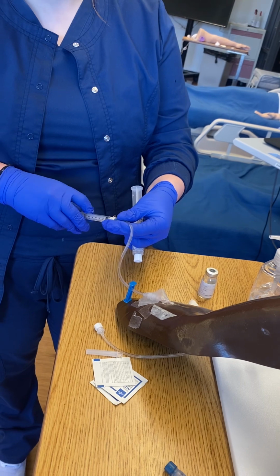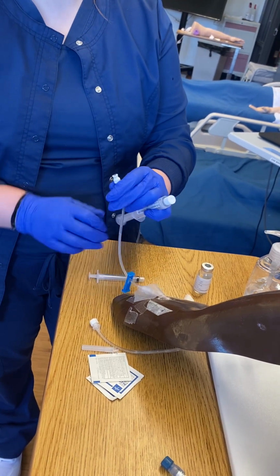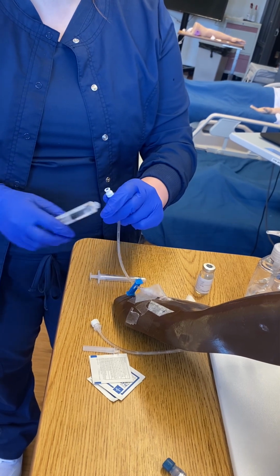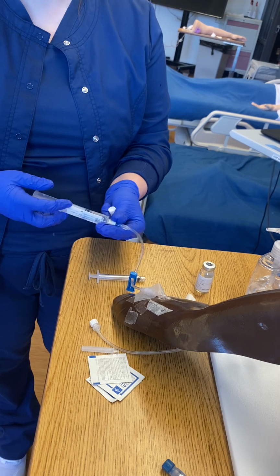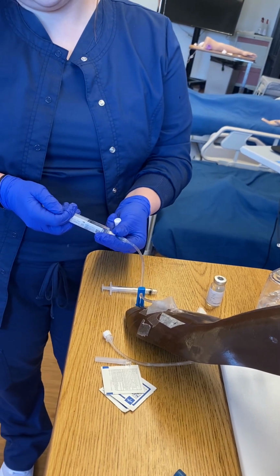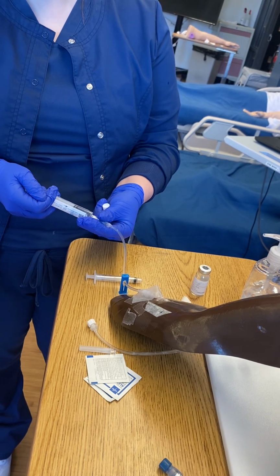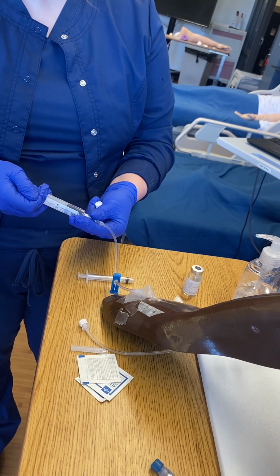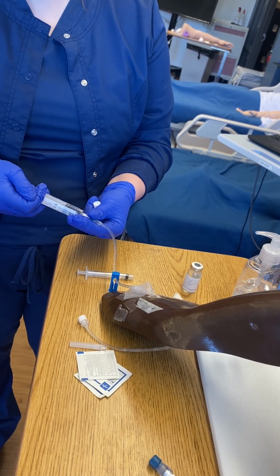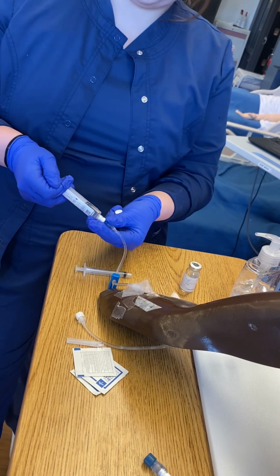All right, and then after a minute of that, take that off, give it another flush. For my second flush, I want to do it for the same amount of time that I gave the medication for. So I would give this for a minute, making sure the line is clean of the medication. Nice and slow, again for a full minute.